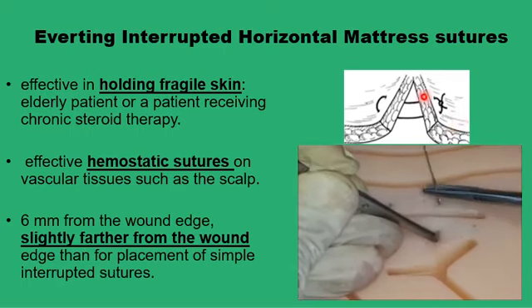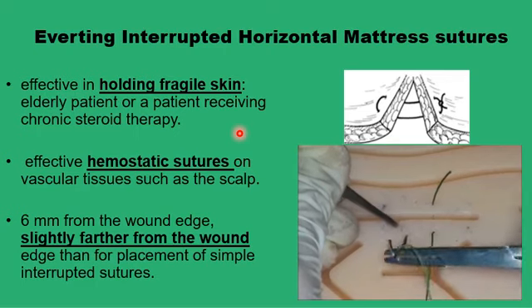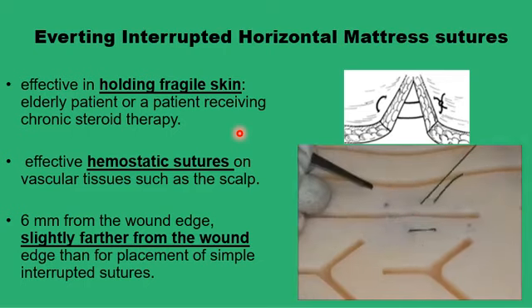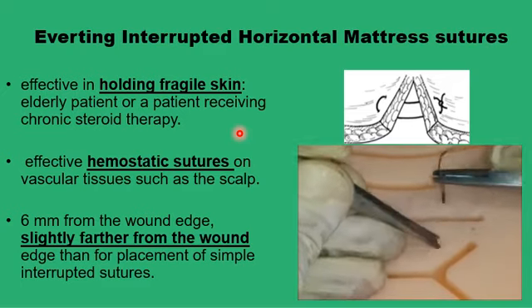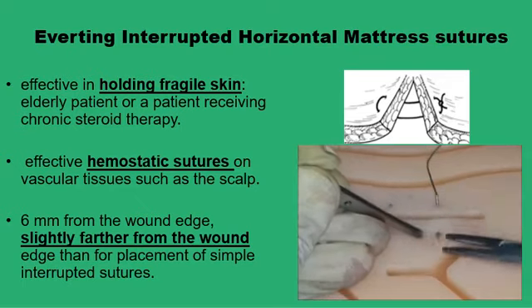configuration to cause eversion. It also is quite useful in holding fragile skin, like in patients who are elderly or have been on chronic steroid therapy for a while. It's also useful as a hemostatic suture, particularly in wounds in the scalp, for example.